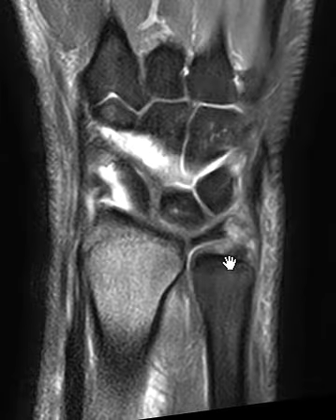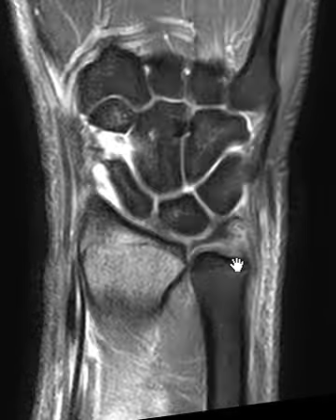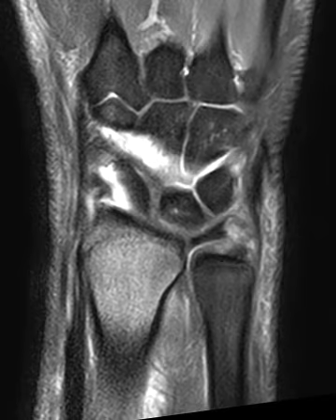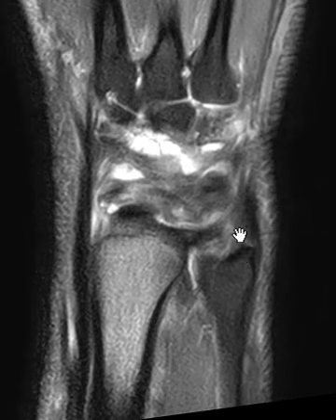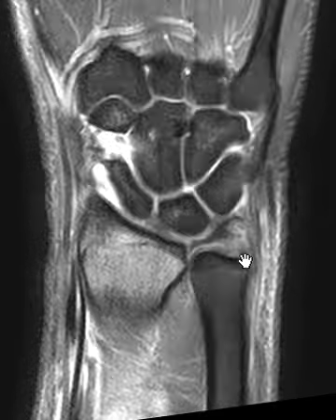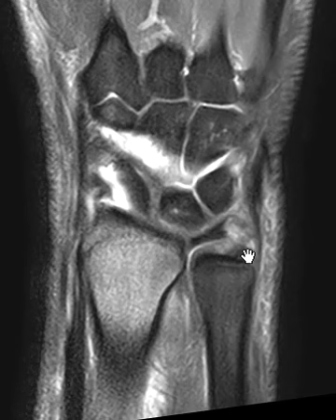If we go even further out towards the ulnar aspect, we should see two more attachments. One attaches to the ulnar styloid, and we really have a hard time seeing the ulnar styloid on this view, but it's right here — there's the ulnar styloid. We just don't see the TFCC coming down here and attaching nicely, so they have a torn attachment to the ulnar styloid. Again here's the styloid, and here's the TFCC coming out here, and up here is the styloid attachment.